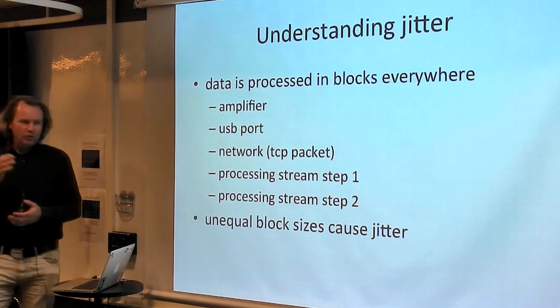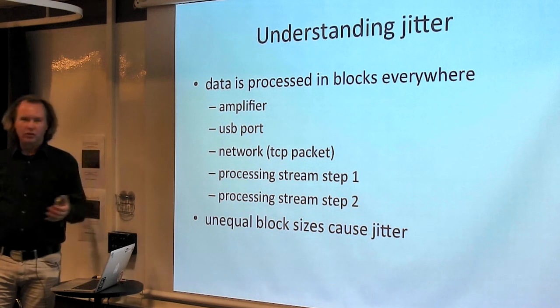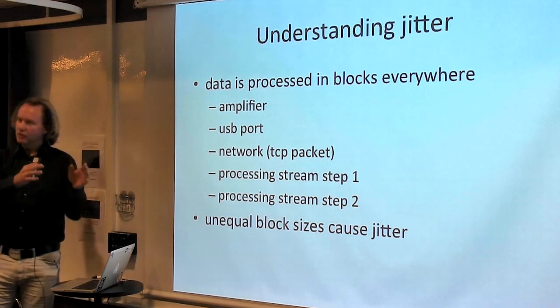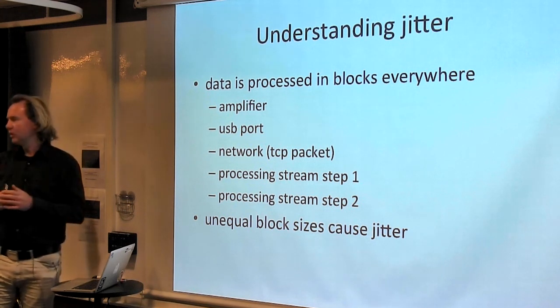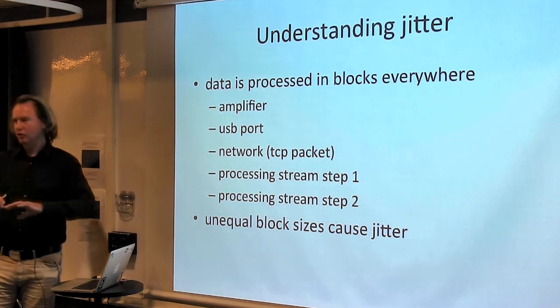Although with the FieldTrip buffer it's very easy to access the data, and it's very easy because it represents a ring buffer to work with arbitrary block sizes, understanding the block size while it's passing through the system still helps in making the timing of the system more accurate and in reducing jitter.